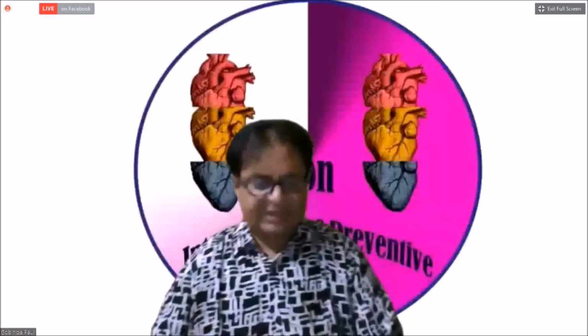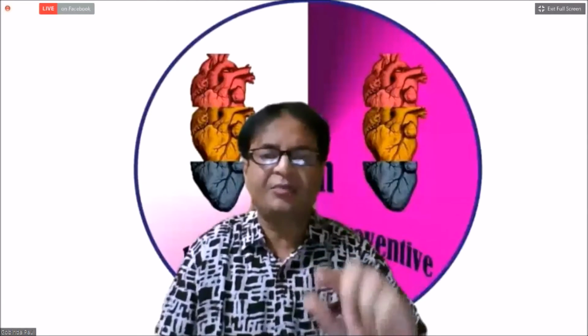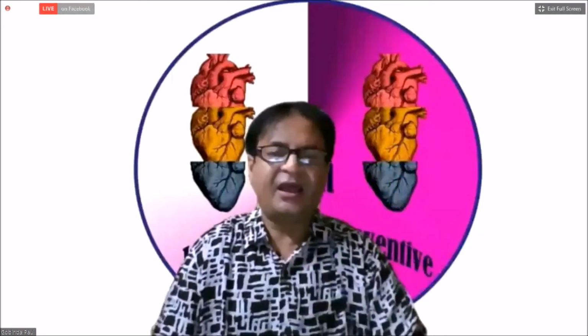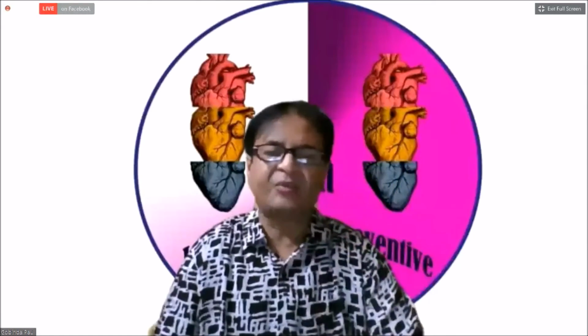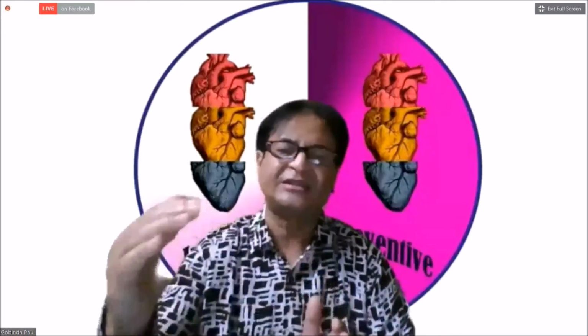Yes, EPSS, E point septal separation, is usually measured from the E point to the inner edge of the interventricular septum. It is the vertical height. It can easily be measured by M-mode echo. Usually less than 8 millimeter is normal. More than 8 millimeter means the left ventricle is gradually increasing in size.